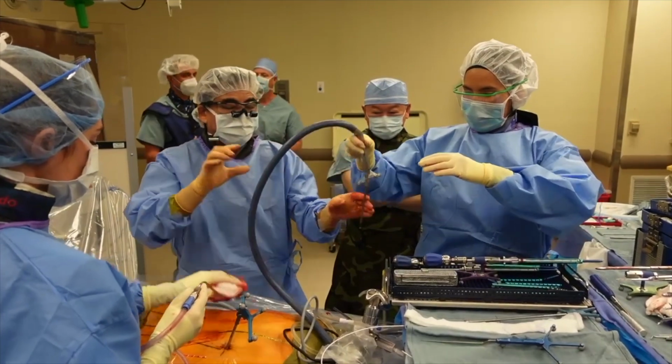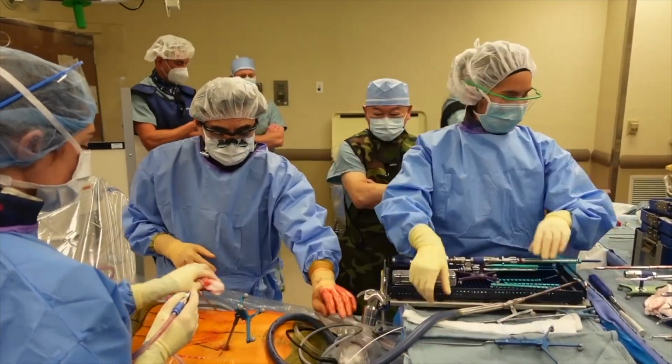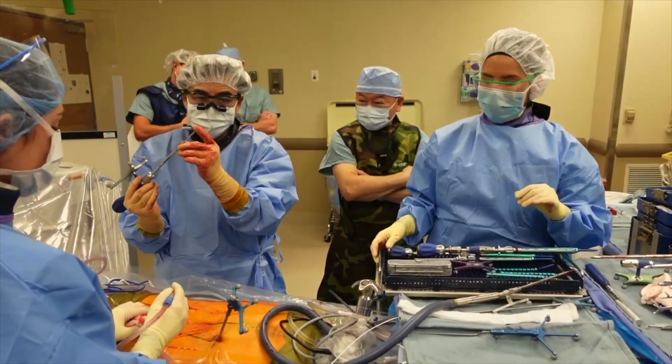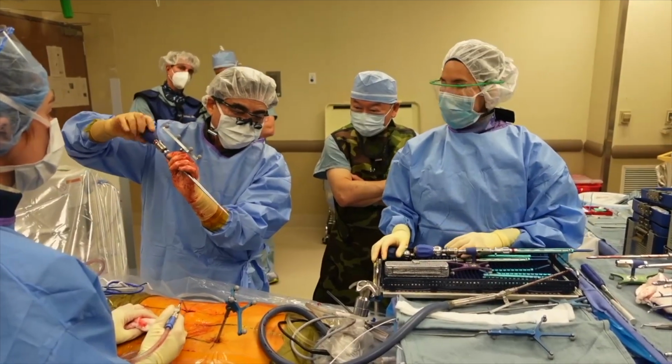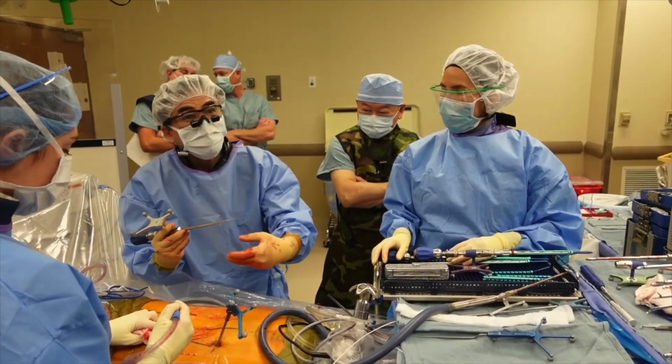Okay, now that I've started the perfect starting holes, I can use the thoracic gear shift probe. I'm going to stick this little tip in, and then I'm just going to go like this and wait for the pedicle to invite me in politely. And I'm going to politely go in.